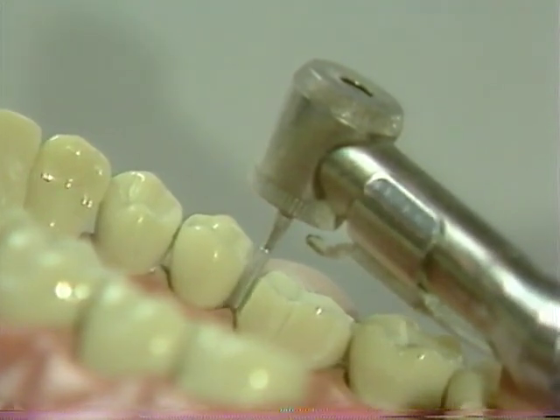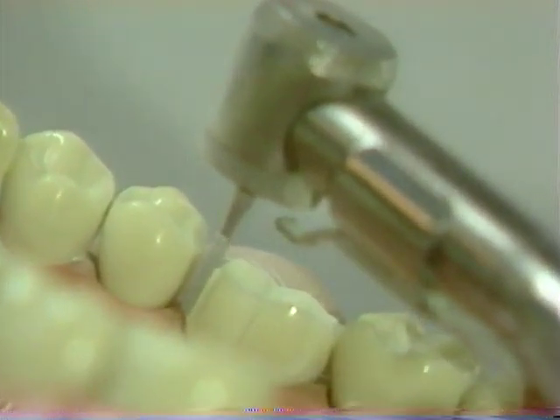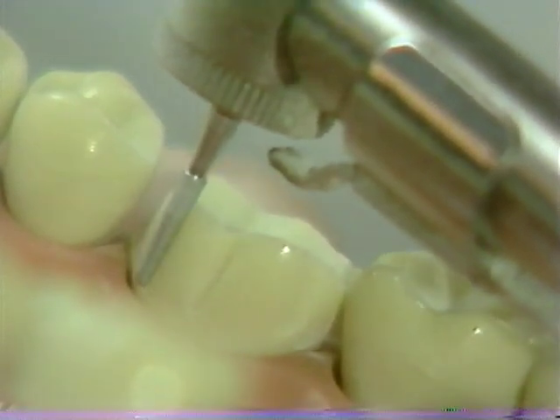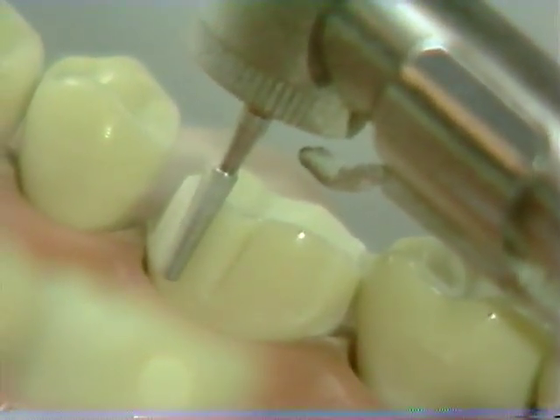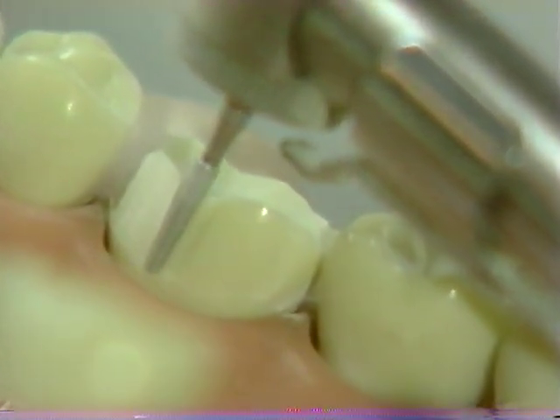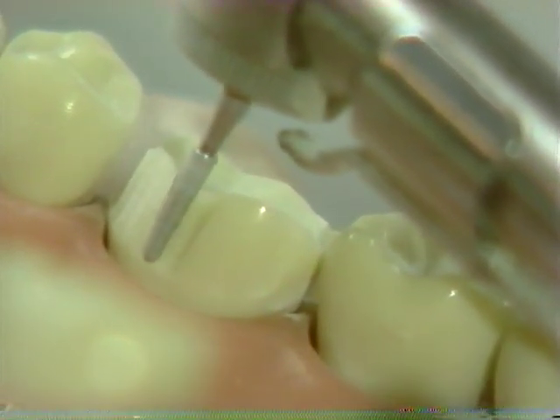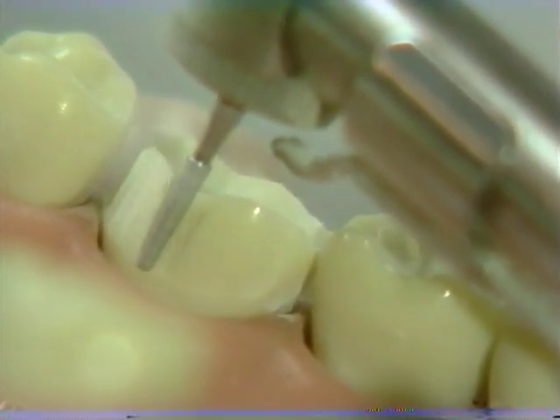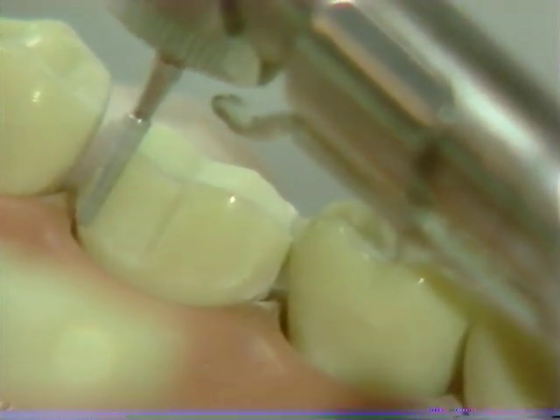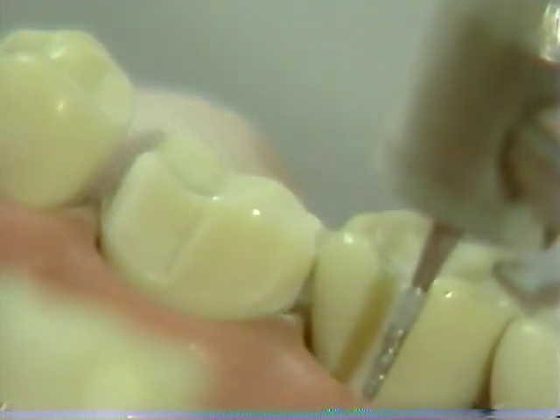The axial reduction is then carried all the way to the center of the lingual surface. Note that the tip of the diamond faithfully follows the contour of the crest of the gingival tissues, and the chamfer is placed in one continuous motion. A reverse pass may be necessary to remove any irregularities made during the initial placement of this margin.